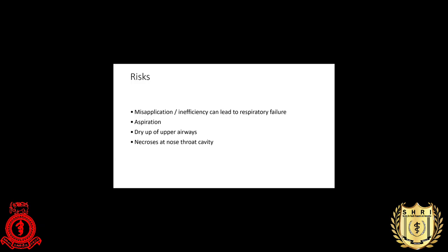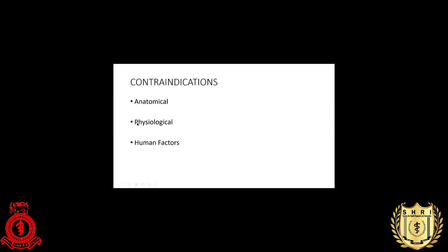The risk is that non-invasive ventilation can cause misapplication, and inefficiency can lead to respiratory failure. There's a high risk of aspiration, especially if you use high values of pressure. If you set the peak value above 10, there's a risk of aspiration. It will also dry up your airway and cause necrosis at the site where the mask is fitting on.